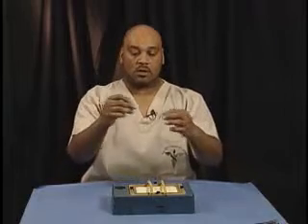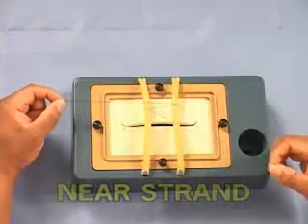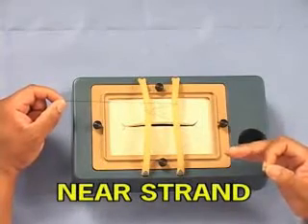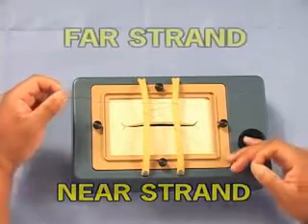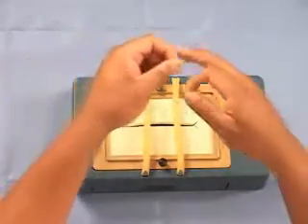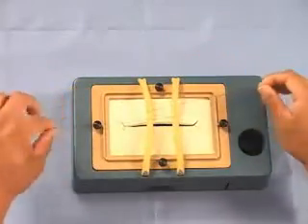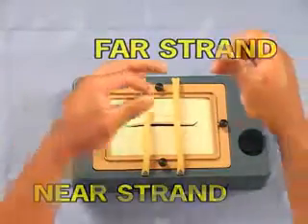Let's look at some key points in performing the one-handed knot. First, we're going to cross our strand. This will set up our first two key points, the near strand and the far strand. If we look down at the strand, the near strand is the strand closest to me, and the far strand is the one further away. If I cross the strand the opposite way, the near strand and far strand just changed hands.